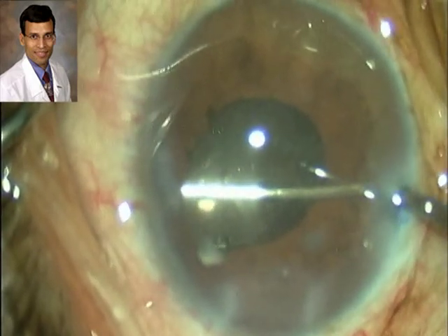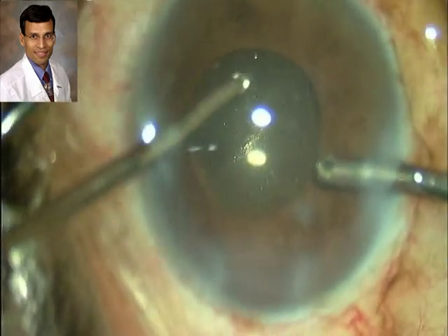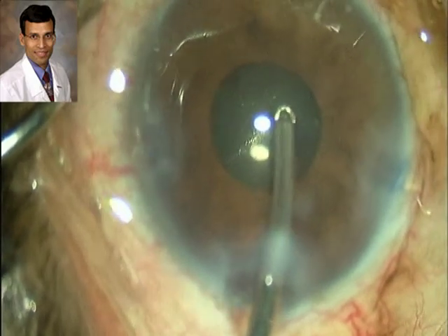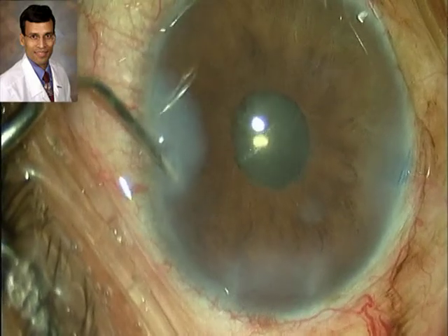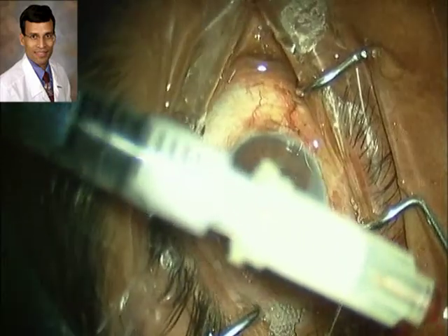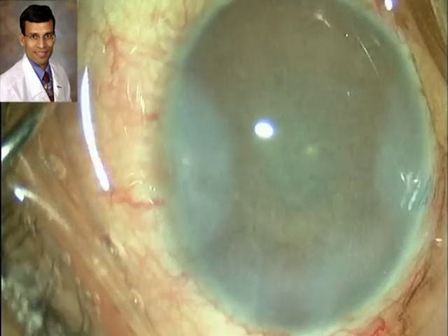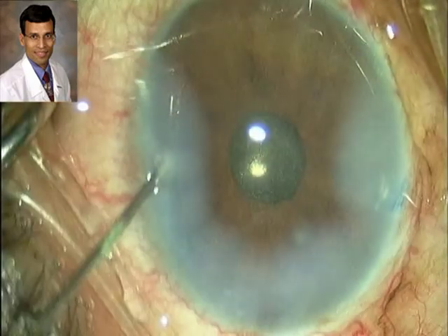Some of these traumatic cases may have compromised capsular bags or compromised zonules, and then the surgical technique needs to be varied accordingly. Because there is increased trauma in these cases with manipulation of the iris, we must do a good AC wash at the end of the surgery and remove any debris that may be present in the anterior chamber. We also sometimes use intracameral preservative-free triamcinolone to provide some post-operative anti-inflammatory effects in these operated cases, and also in those cases where we need to see whether there are any vitreous strands to stain the vitreous fibers.